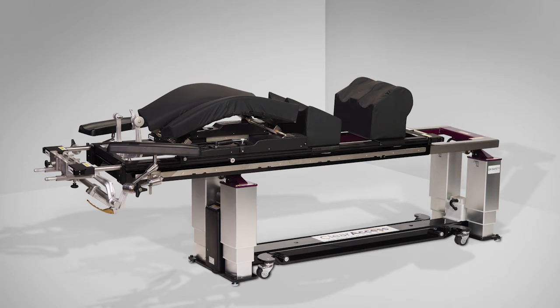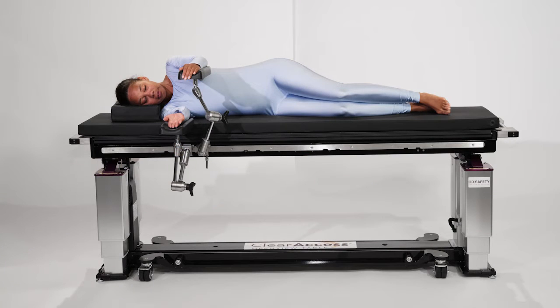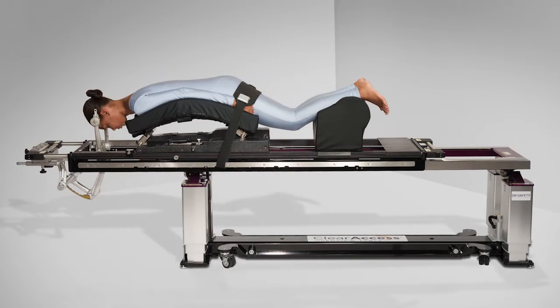In this video, we will highlight the Clear Access NeuroCervical Configuration, the most broadly capable version of the Clear Access Table. It supports anterior, posterior, and lateral spine procedures, and with the use of the cranial stabilization system, can support brain surgery or cervical spine procedures that require cranial stabilization.